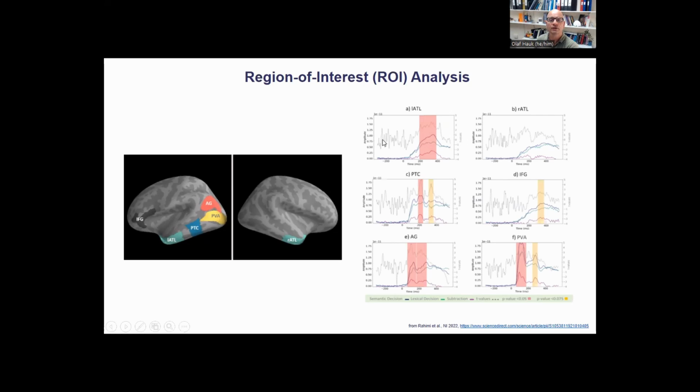Again, this is the t-value here, this black line here. You can see that it's quite noisy data, so that's what you get in language experiments. T-values go up and down. Sorry, the scale of the t-values here, this is the value of 2 in this case. So sometimes you might just reach the value of 2. That would be significant at the uncorrected level.